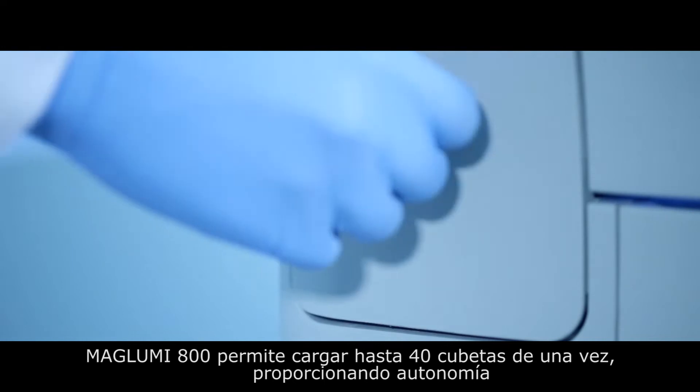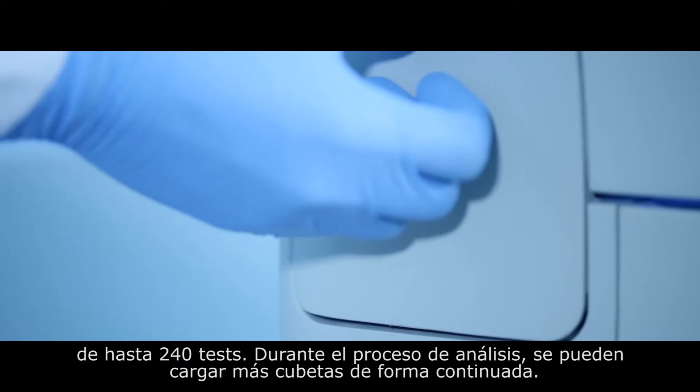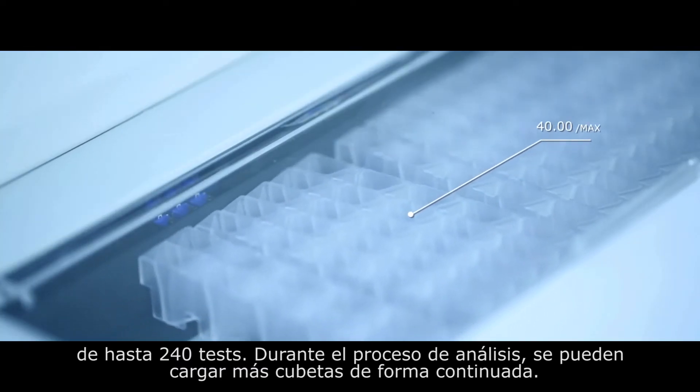Maglumi 800 can load up to 40 cuvettes at a time, which can run 240 tests during testing. Cuvettes can be continuously loaded.